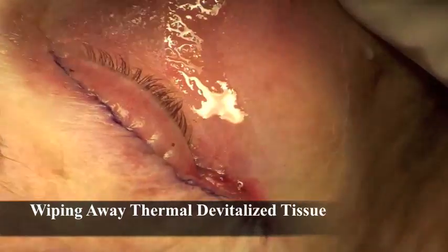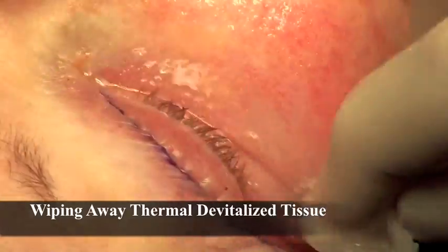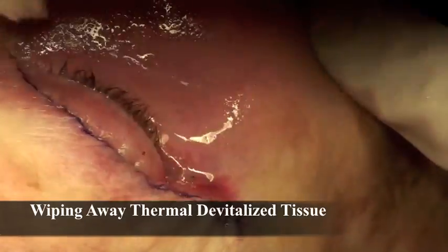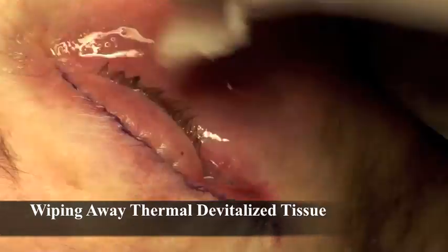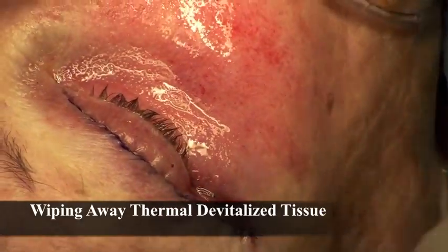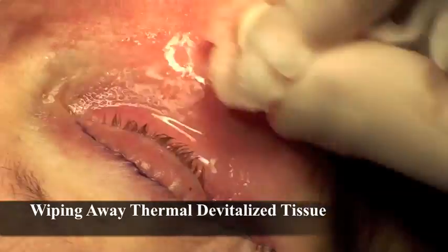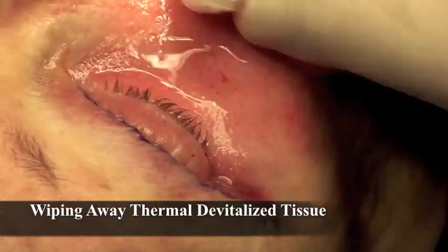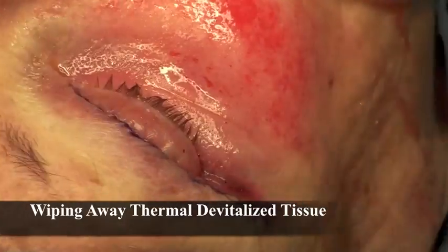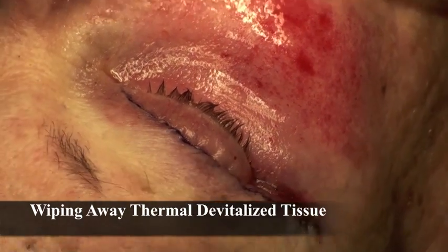At this point, I wet a gauze and wipe away the thermally devitalized tissue caused by the first application of the laser. I vigorously rub the skin in this area, and sometimes I can get petechial bleeding as I get into the papillary dermis. I feel that this process creates a smoother framework by which the resurfacing can occur and leads to cleaner ablation and better depth penetration.